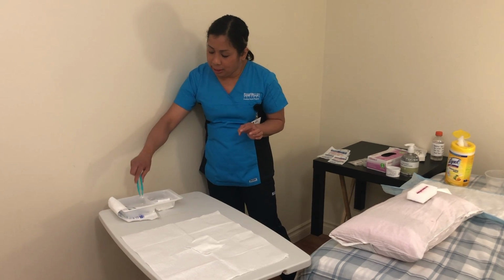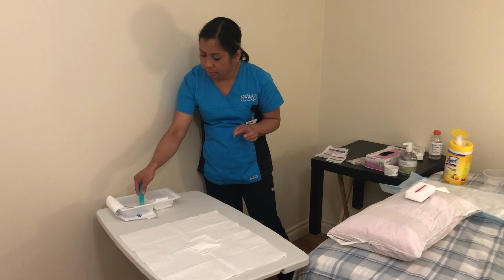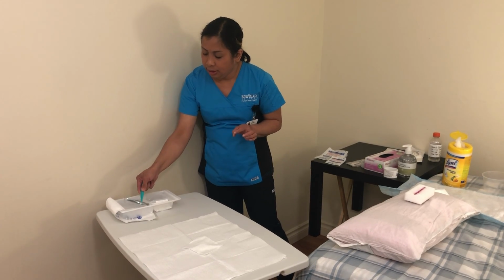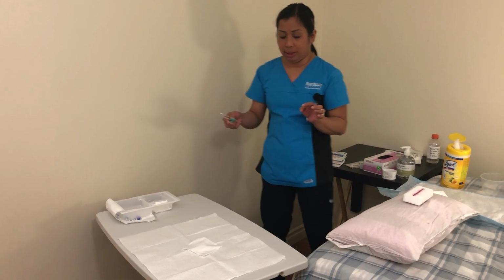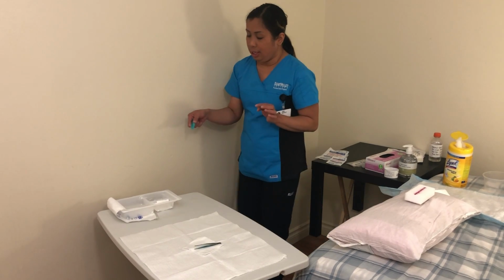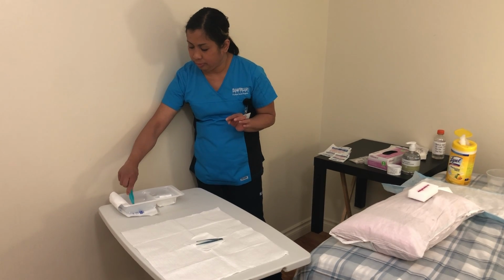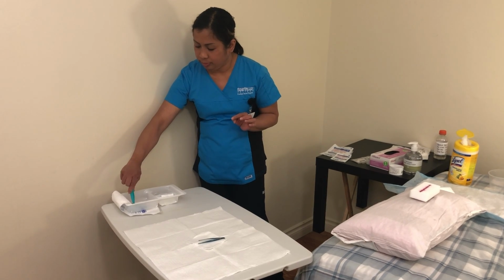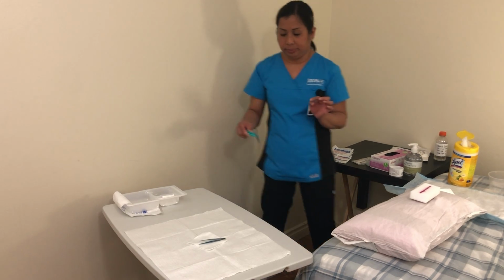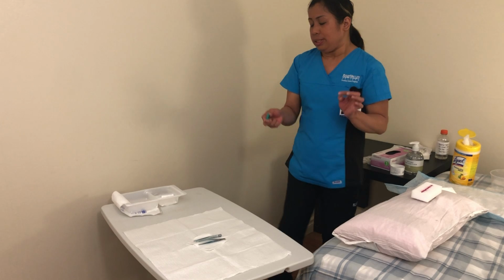Now, I'm gonna pick up the forceps. This is the forceps. Okay, here I'm gonna do this one like this, and then the other forceps too. Here. All right.